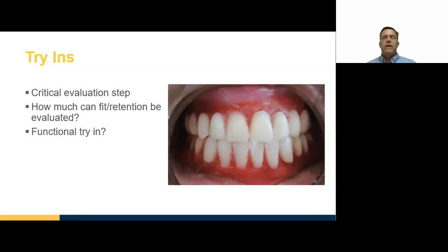We'll talk about some of the different partials. You can't try the clasping until the final appointment. So we want to talk to the patient about stability. And again, when we approach this thinking about it like our patients do, stability is going to be one of their larger challenges. If we're doing a traditional workflow for our dentures, there'll be a little bit of blockout, so the base plates won't fit as snugly as the final restoration, but they'll be similar.